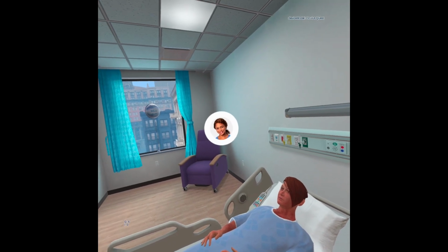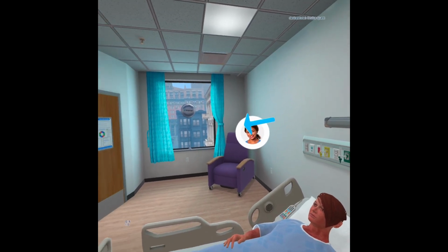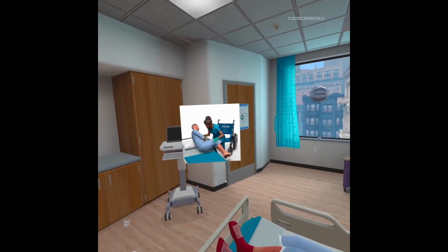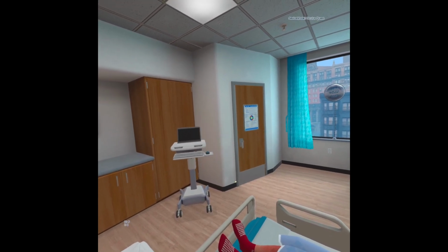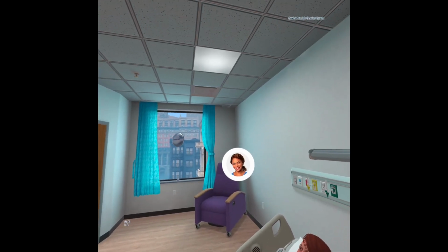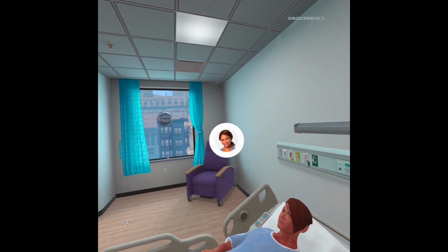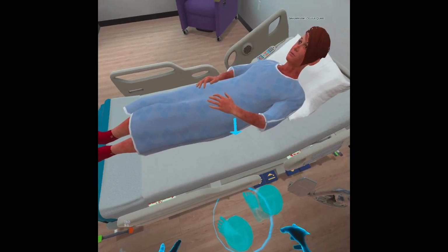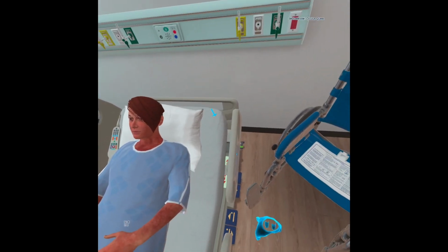First, we need to position our body to use proper body mechanics and reduce risk of injury. Watch the movement required to sit the patient upright. Pay close attention to the healthcare provider's leg and body position. Turn to face the patient's hips at a diagonal with your right foot slightly in front of your left and your feet shoulder-width apart to create a base of support. Bend your knees slightly. Stand here to get into the correct position. Touch the up button to raise the head of the bed about 15 degrees.